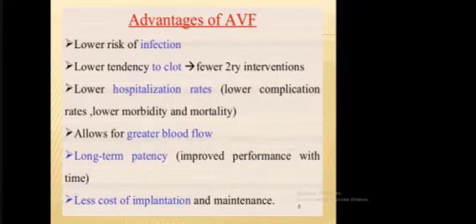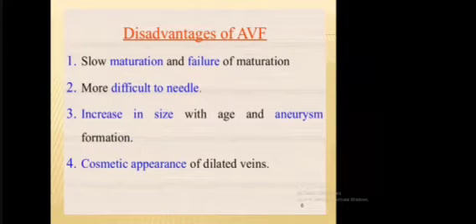What are the advantages? Lesser infection, lower tendency to clot, fewer secondary complications, lower hospitalization rate, it allows greater blood flow, long-term patency, and less cost of implantation and maintenance. What are the disadvantages of AVF?